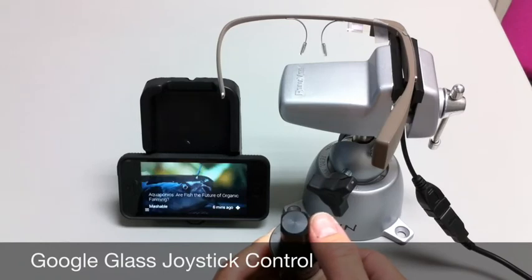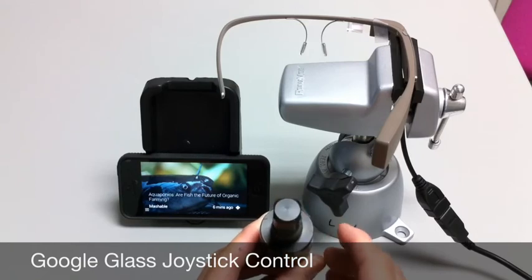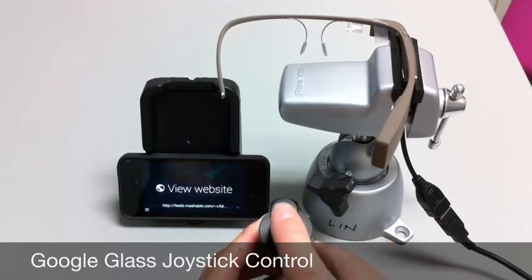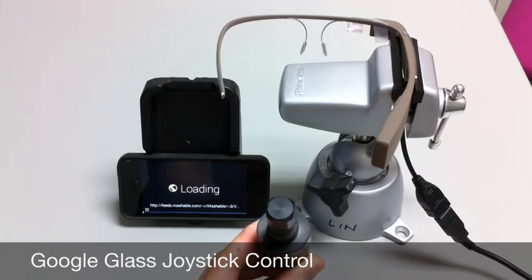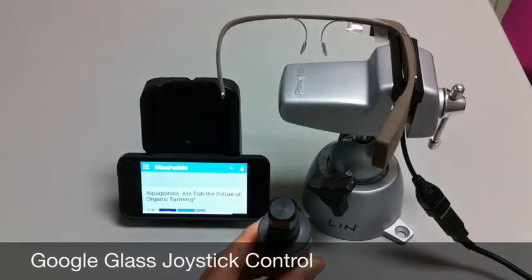I'll go to the Mashable item on the timeline, and I'll select it with the fire button. And that emulates the tapping motion on the touchpad of the Google Glass. And as you can see, it's starting to load the website. And there it is.